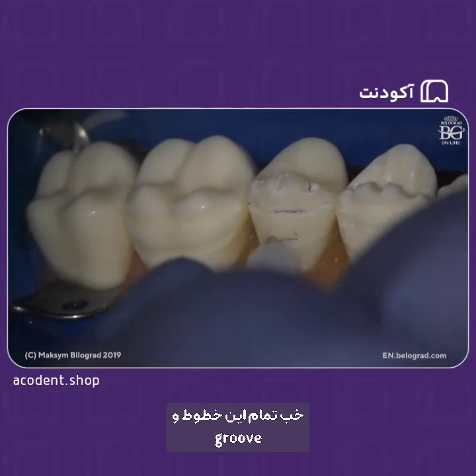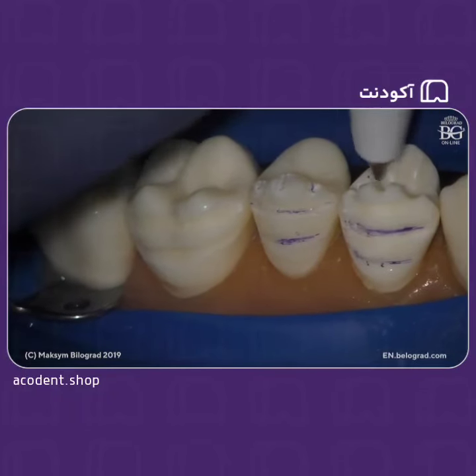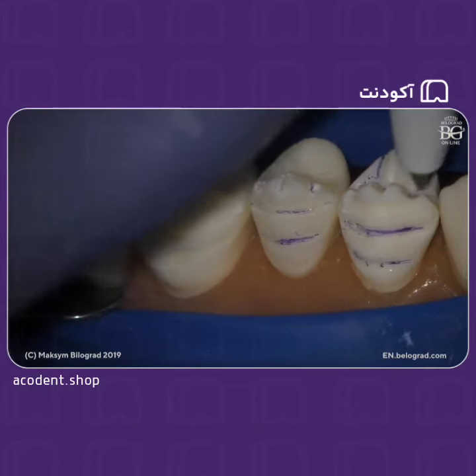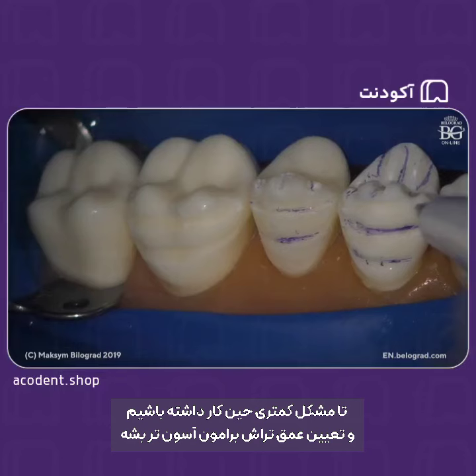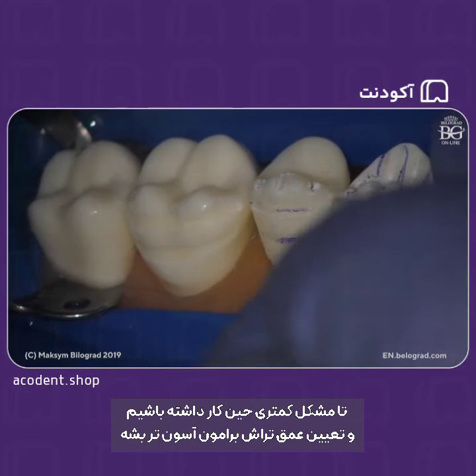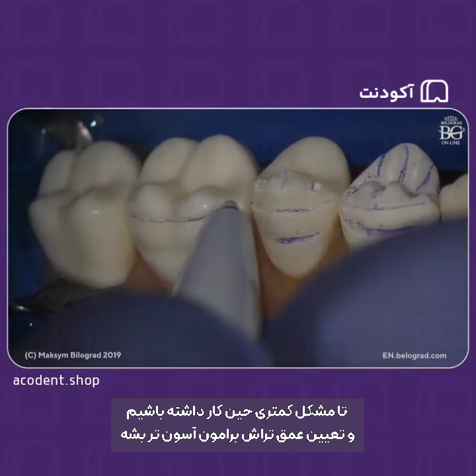Okay, so we mark all these lines, all these grooves, the occlusal surface also, so that we will have fewer problems in orientation. It will be easier for us to determine the amount of our preparation. Okay.